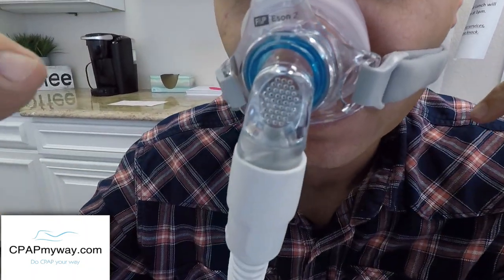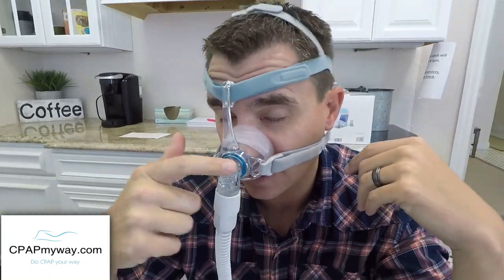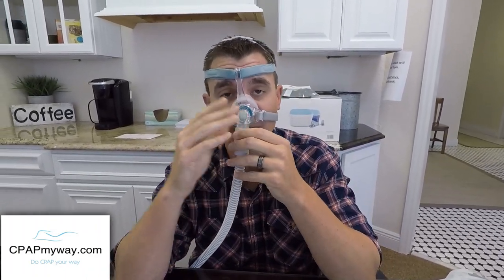Though if I take the diffuser off, which does pop right off, then you could hear some of that exhalation. It will run without the diffuser if you lost it or something like that, but it is a big difference when you're running it with and without the diffuser. There's just no noise at all, and there's no draft coming out of that exhalation. So somebody sleeping beside you is really going to enjoy that. I can speak for sure from that front.